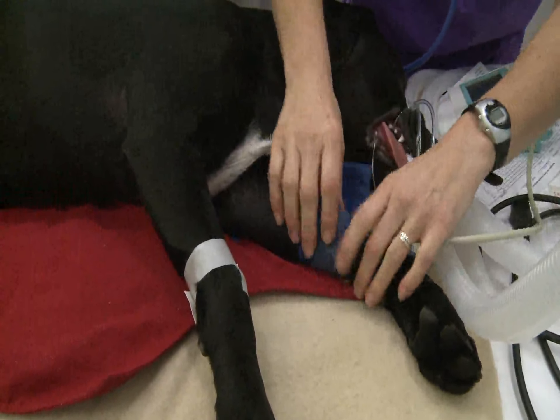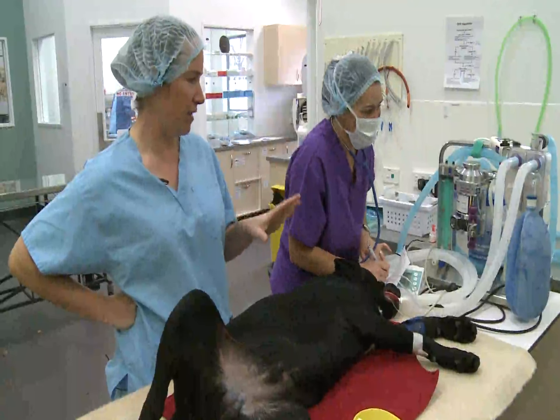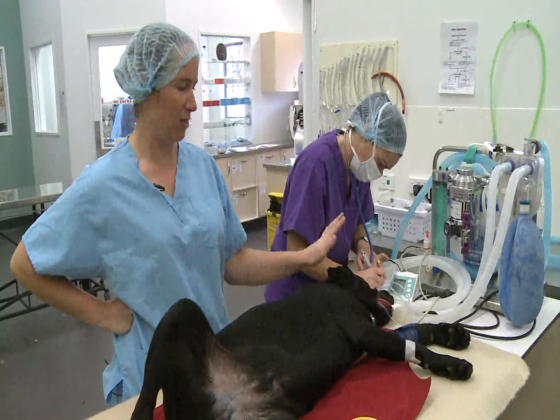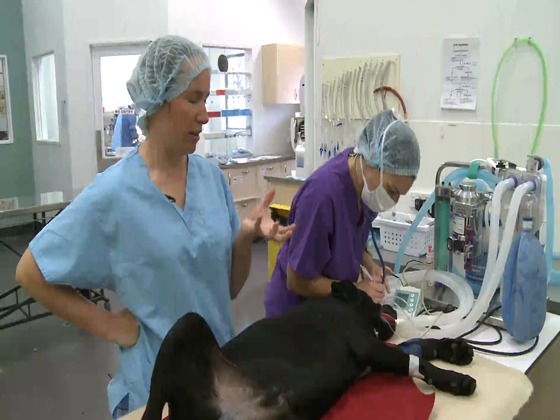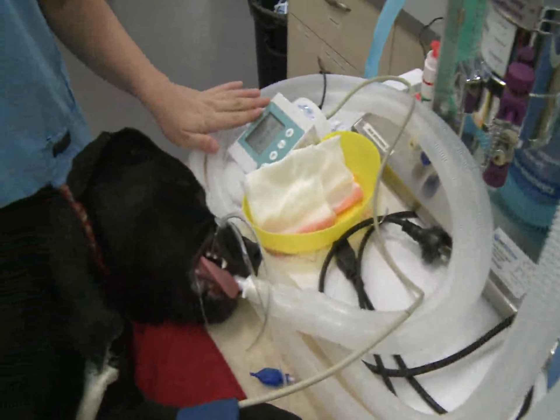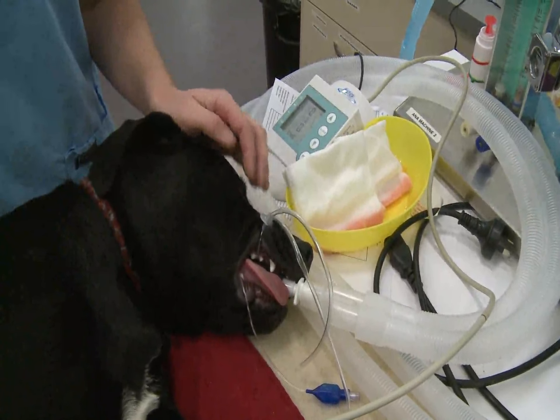By taking away these little testicles at an earlier age, we can help reduce the incidence of prostate problems later on in life as an older dog. The main thing under anaesthetic is that we're monitoring blood pressure. If that blood pressure drops, it can have effects all over the body, not to mention the brain and the kidneys. It's basically the pressure generated by the heart trying to pump blood and oxygen around the body. Because we've knocked him out, one of the biggest problems with anaesthesia is that we can drop their blood pressure, so we need to keep a really close eye on that.